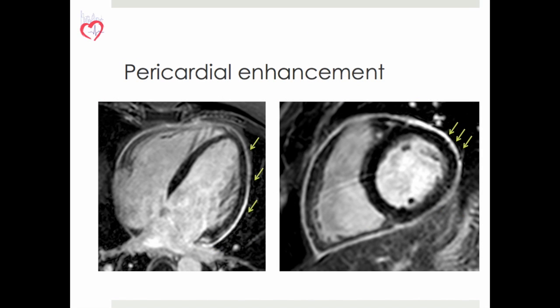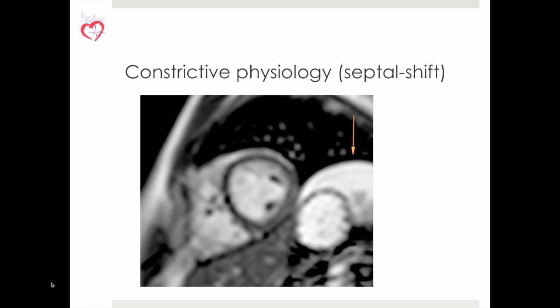Also common in non-ischemic cardiomyopathies is a rim of pericardial enhancement.